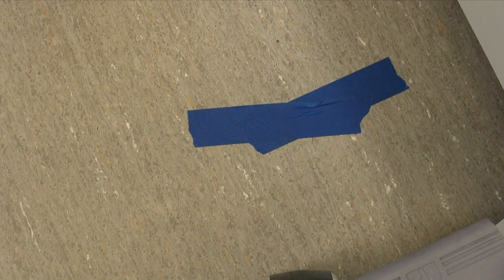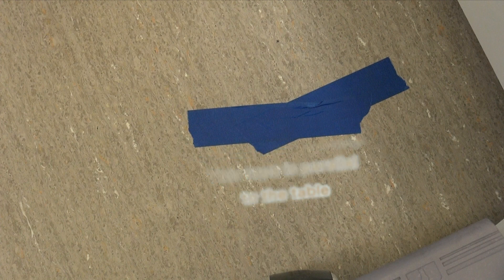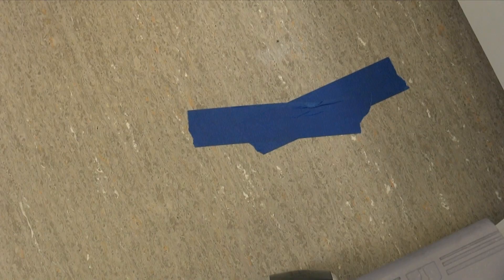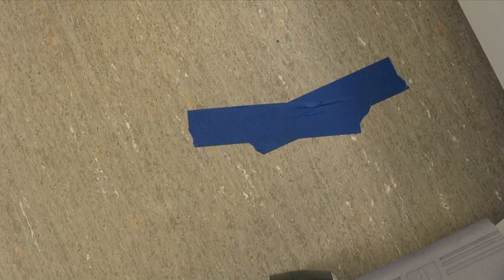So we have two pieces of tape on the floor. One of them is just parallel with the table, and that'll be for the one where we just go back and come back in again like we always did in the old days. And then the other tape has got about that 20 to 30 degree angle to it, and that'll be the one where we'll go out and come back in and show you how much better it works.